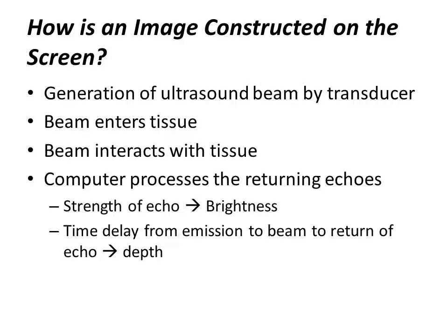Now the other important thing is that the way depth is measured on the ultrasound screen is based on the time that the ultrasound waves take to come back to the transducer. The speed of the ultrasound wave through the tissues is a constant, which means that the distance is directly proportional to the time taken by the waves to go to the tissue and come back.